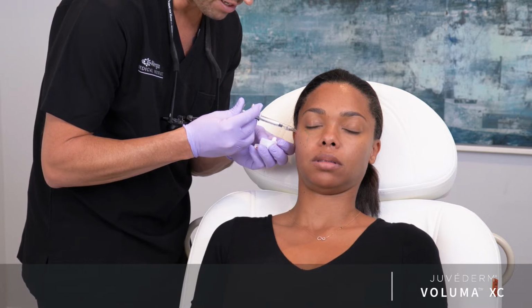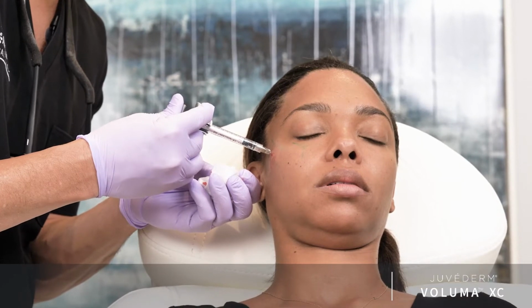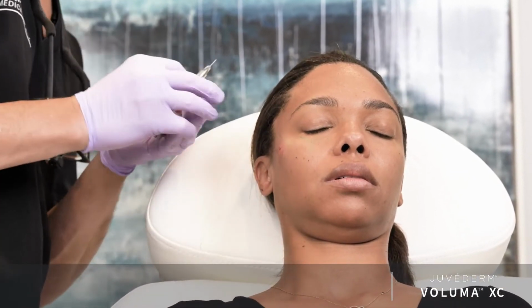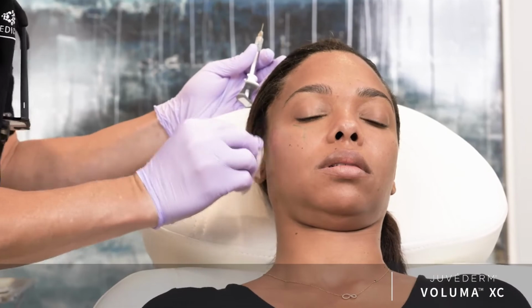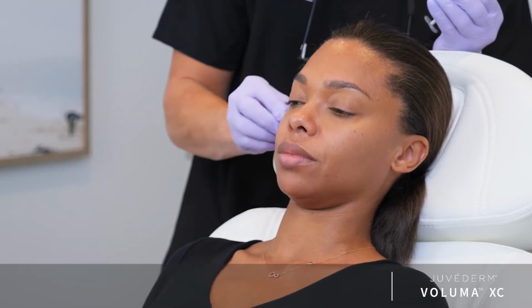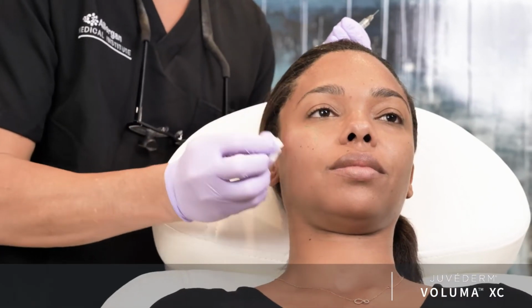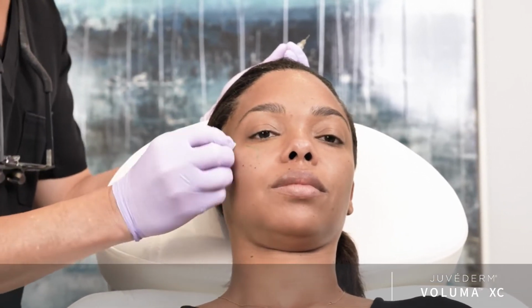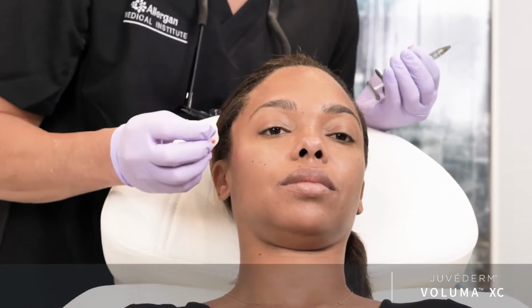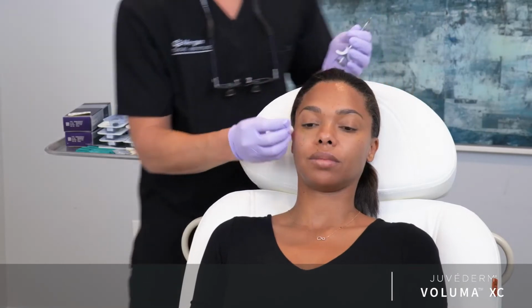And this again will be 0.2 cc's, this injection point. Throughout the entire injection, I'm assessing the aesthetic result by looking at the zygomaticomalar area from a 3/4 angle. In my case, I'm looking from behind in an oblique angle to assess that nice convexity that we've now achieved on this right side. And I can compare the two sides from above, and I can see this nice projection of the right zygomaticomalar region.